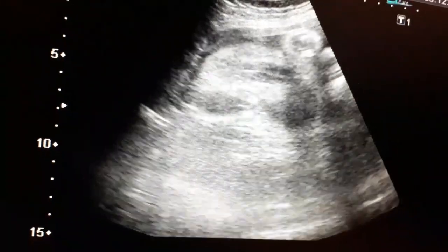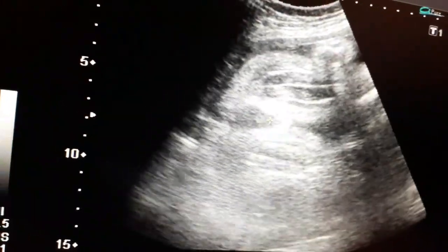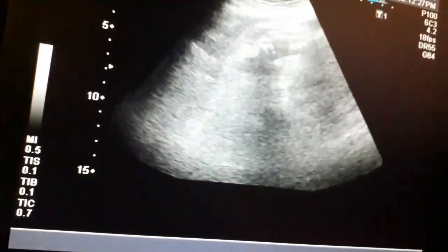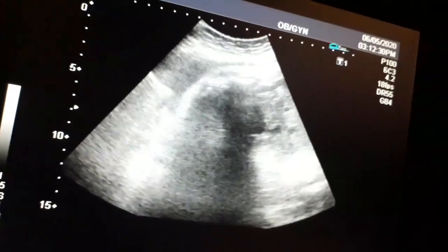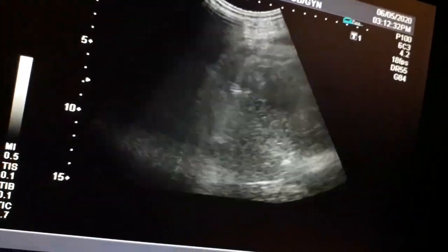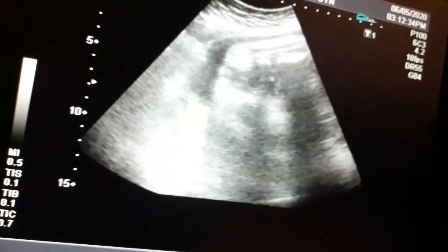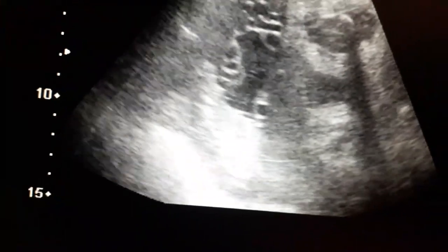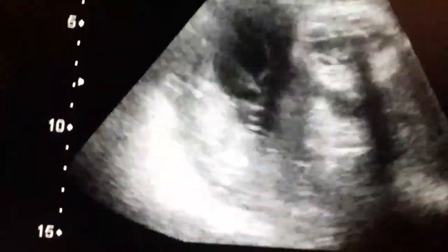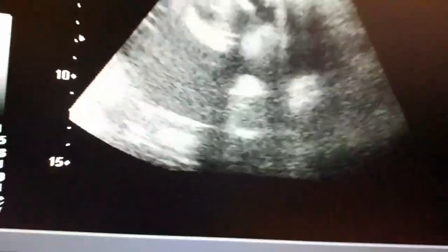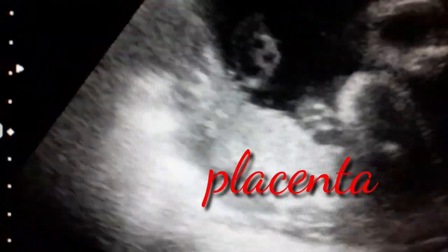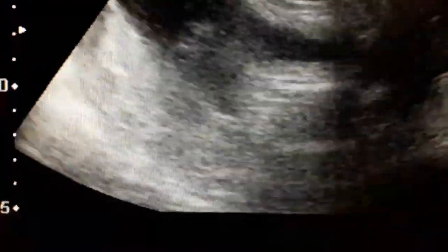Again, this is the sex — the female genitalia showing the burger sign. You can also appreciate the placenta, which is fundal and on the posterior side. It is grade three; the majority of the placenta is grade three — this is a fundal posterior placental position.